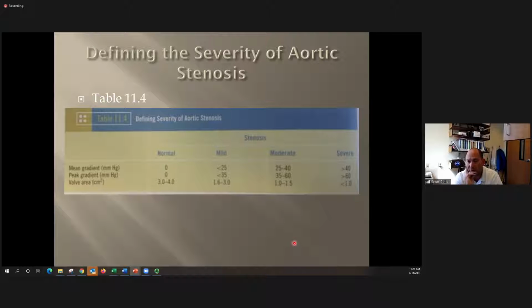Okay. So we can more directly measure LVOT cross-sectional area. We still make assumptions, but not the same, because the aortic valve, when it's stenotic, can be very odd shaped and it's very hard to make assumptions about. And it's more important that we get accurate measurements there anyway, because we sometimes base the surgery decision off of what we find.